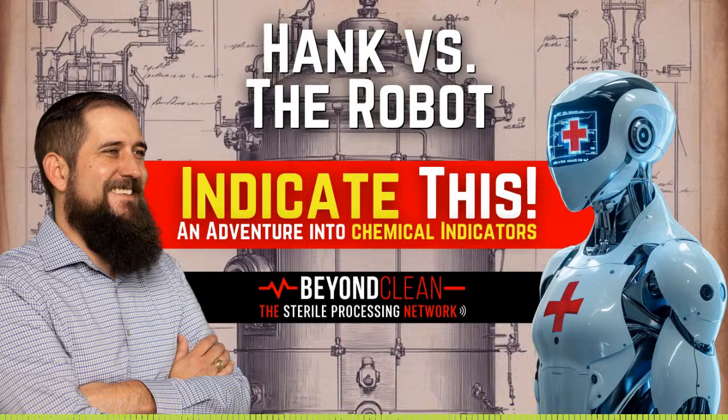Scenario 2. Poor placement. Where you place the indicator or integrator matters a lot. If it's in an area of the load that gets ideal sterilization exposure, but the rest of the load doesn't, like a corner of the sterilizer with better steam penetration, it can give you a pass when other items in the load weren't fully sterilized. For integrators, this is less common because they're designed to mimic the worst case scenario, but poor placement could still affect their accuracy if they aren't located in the most challenging spots.